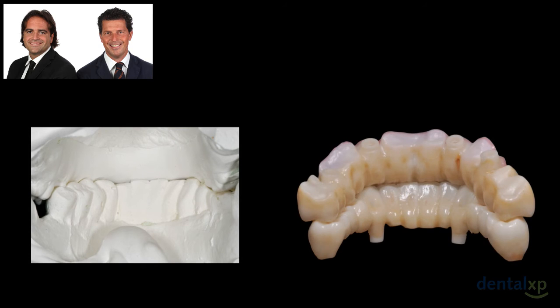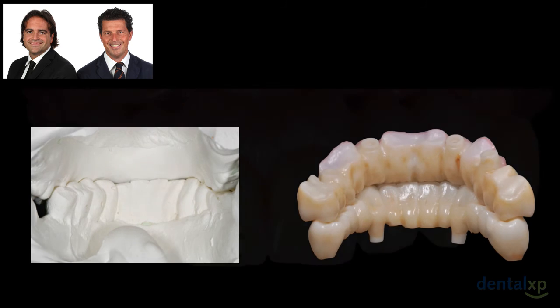Look how the function, especially in Sergio, has been checked carefully, and look how it changed from the beginning of the study model on the left side to the right side, in where we have the 2 arches, one on top of the other, characterized and functionalized in the most precise way that we can.